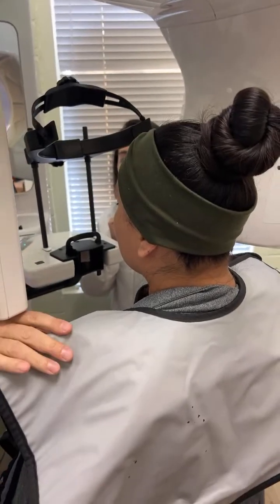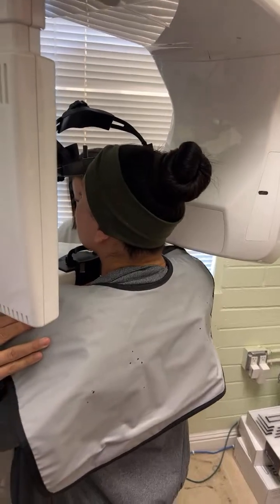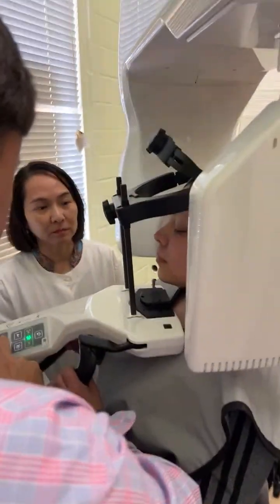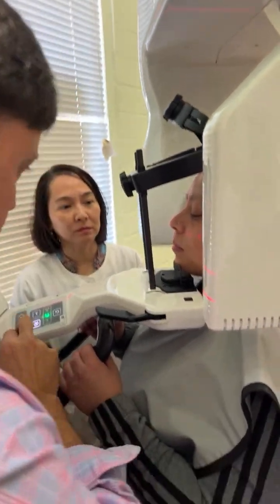Okay. So come on in. Stand up nice and tall, don't slouch, stand up tall. Don't try to get your chin in anywhere. Okay, we're gonna adjust it to you. Okay, so now I'm gonna move it up. See what I'm doing? Okay.